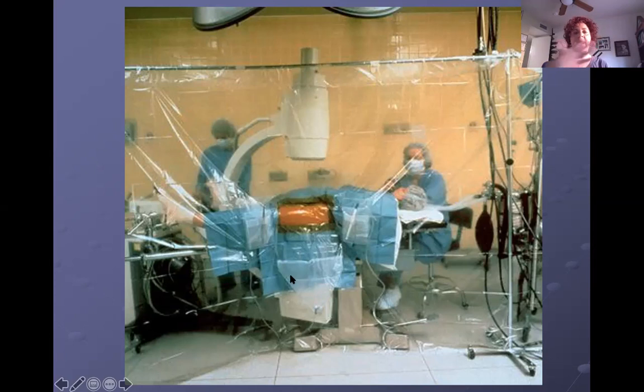This is going to be our side, this side that we're on. That's the sterile side. That other side is where all the non-sterile peeps are going to be. So you can see the C-arm is over there, the rad tech is over there, the anesthesia care provider is over there as well, and we have this big long pole going through the IV pole.